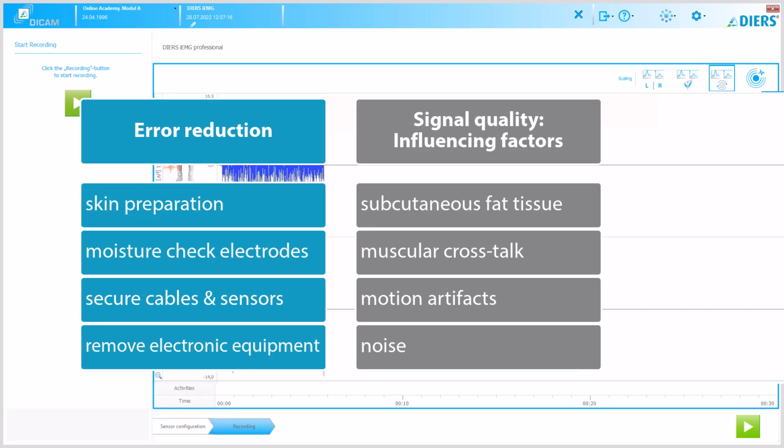Lastly, remember and eventually type down the individual movement pattern with regards to muscle fiber length. This enables me to set up a standardized scenario which can be reused reliably at a later stage. That is, I should check once more that the electrode is still sitting on top of the muscle belly when I am in the measurement position.